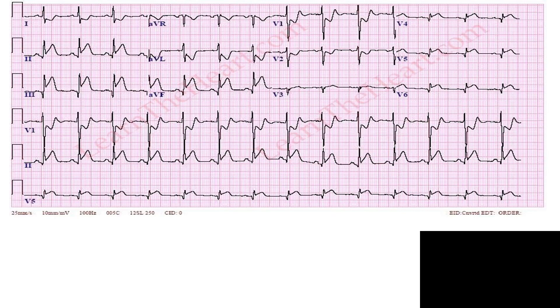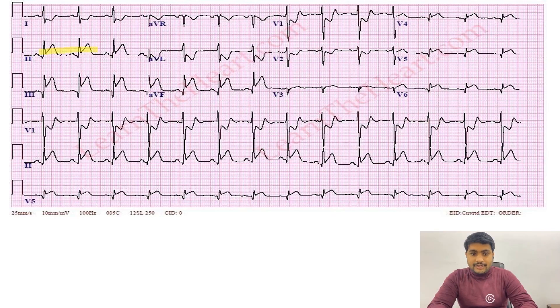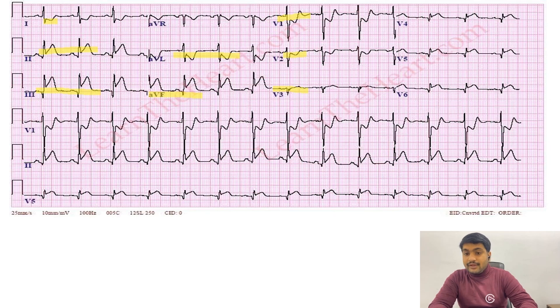This is another example: lead 2, 3, and aVF show ST segment elevation — that is the inferior wall MI. Leads 1 and aVL have ST segment depression. Then we have shelf-like depression in V1, V2, and V3 with a prominent R wave. So this is inferior wall MI plus posterior wall MI with some reciprocal depression in the lateral wall.